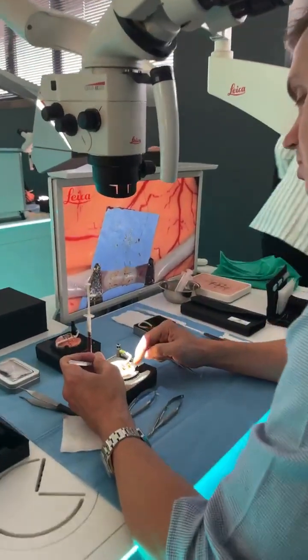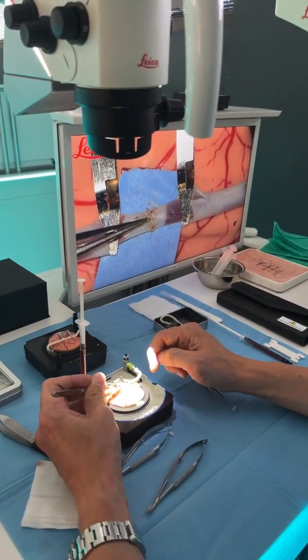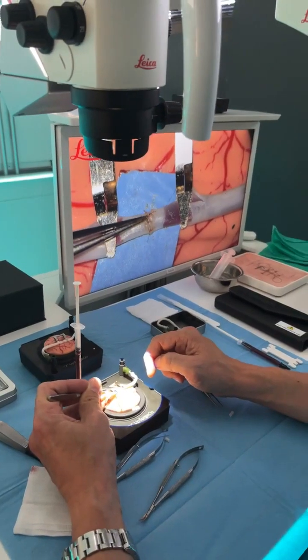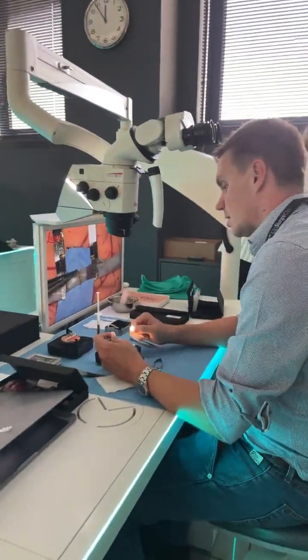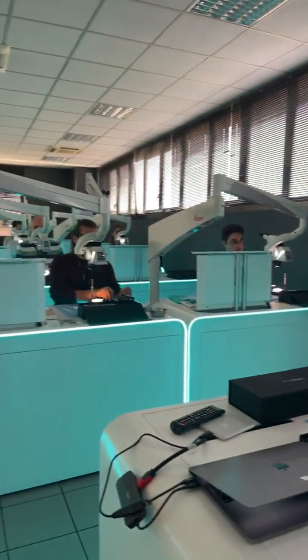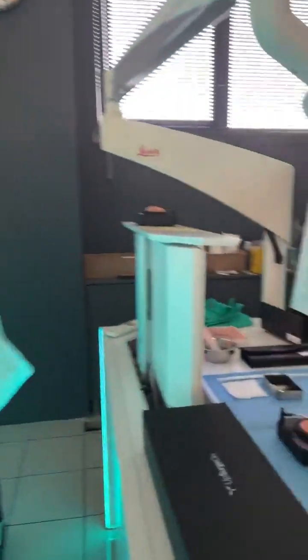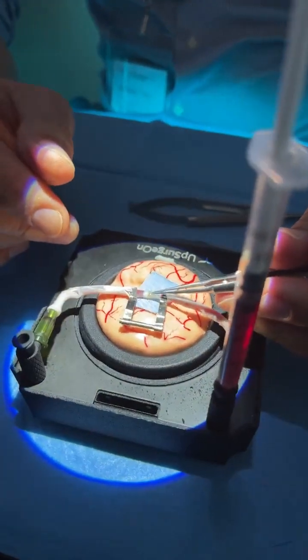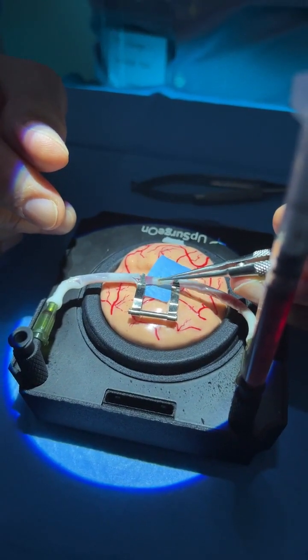Go back on the anterior wall and finish putting the stitches here. Put one stitch here and here. After that, remove the clamp and try the patency test. You may observe some bleeding from the anastomosis — this is normal in real surgery. You can put the clamp again or use your instruments to control the anastomosis and add the stitches that you need.